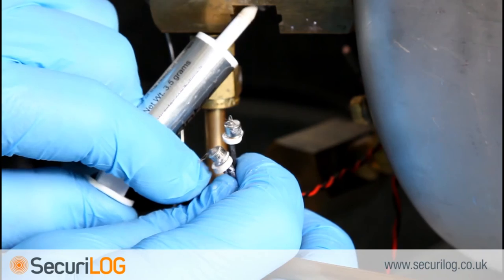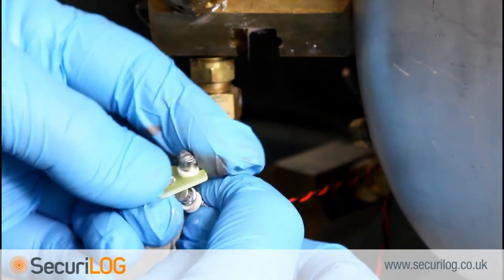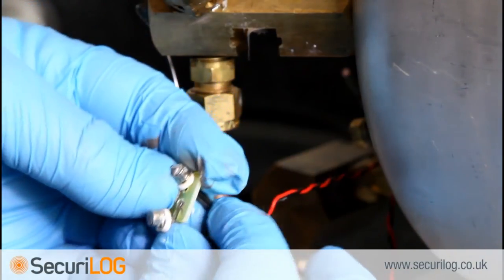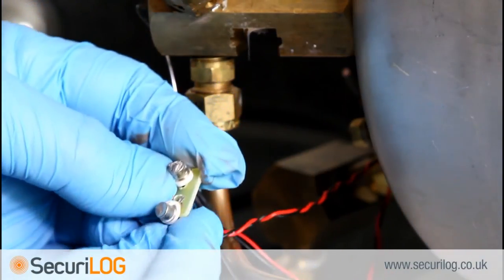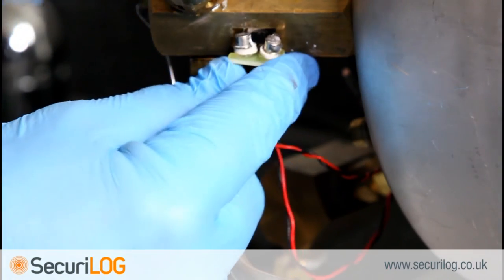Isopharm recommends using the new H-clip provided with the Secure log kit. Insert both the control probe and the Secure log temperature probe into the H-clip, then slide the H-clip into the brass block.